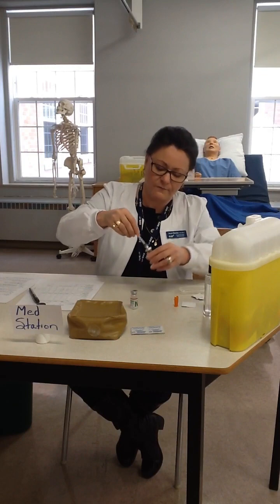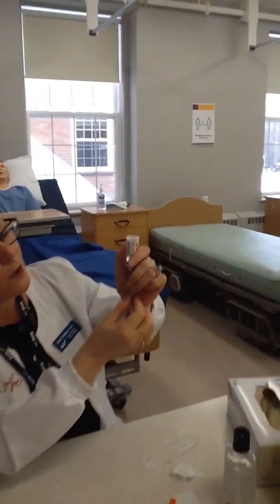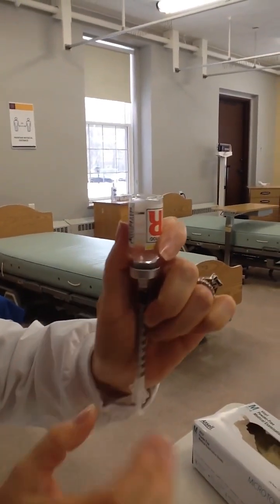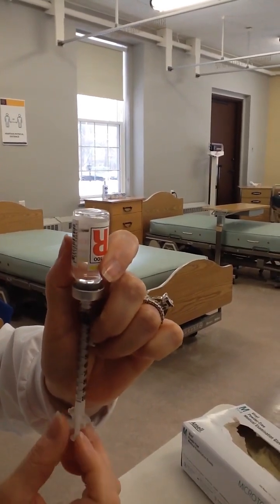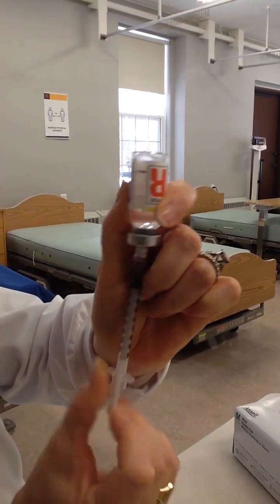And now I'm going to invert the whole unit. And I'm going to be really careful to stabilize this whole unit so that I don't bend that needle. So I'm turning the window towards myself, but it doesn't matter because that needle is so tiny that it's just barely on the other side of that rubber stopper. And I'm going to draw up my 6 units. And so remember that little needle, even though it's small, it has air in it.